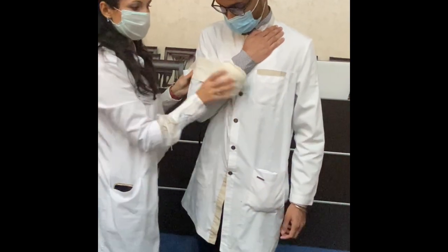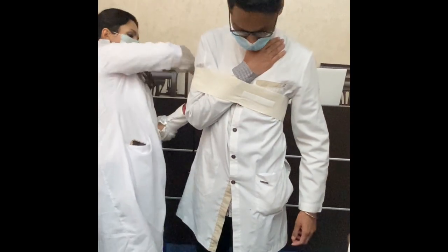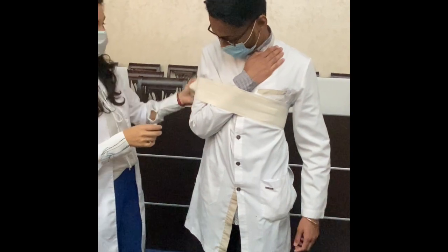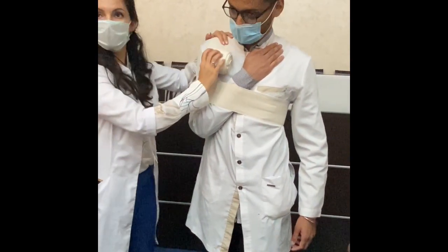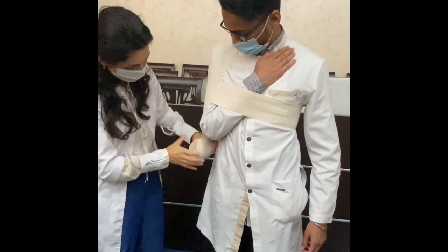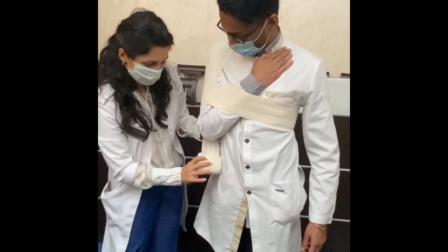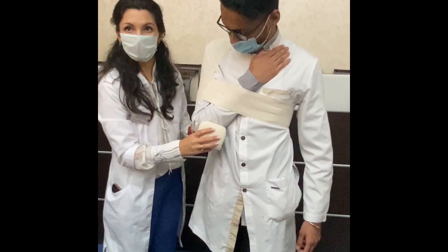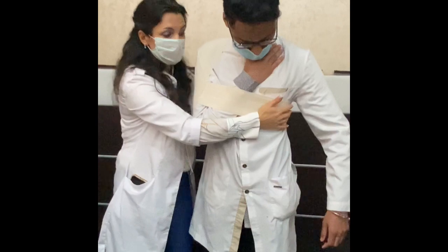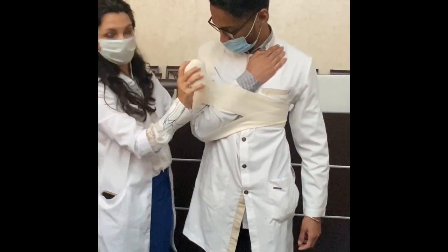And again — I'm repeating — fixation circle. Then you have to connect the bandage on the shoulder to the damage area. In this zone, we did it like this, and we support the elbow like this, and it goes on the shoulder. Then we have to make fixation.